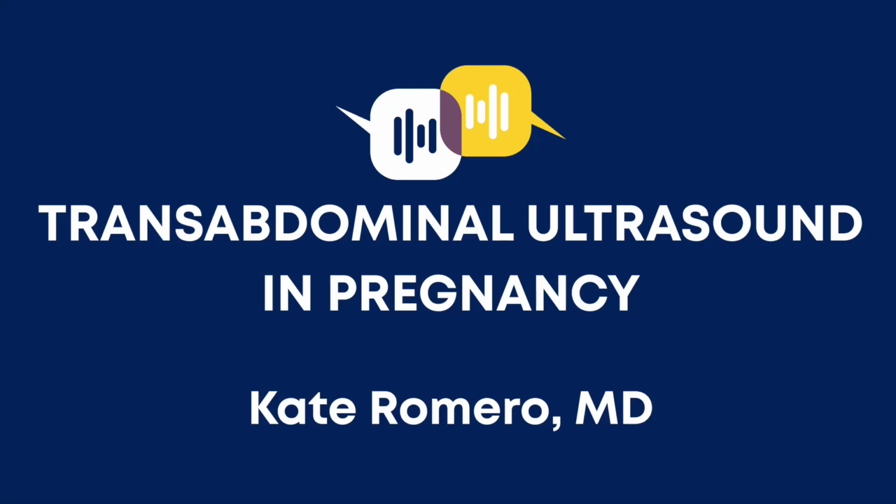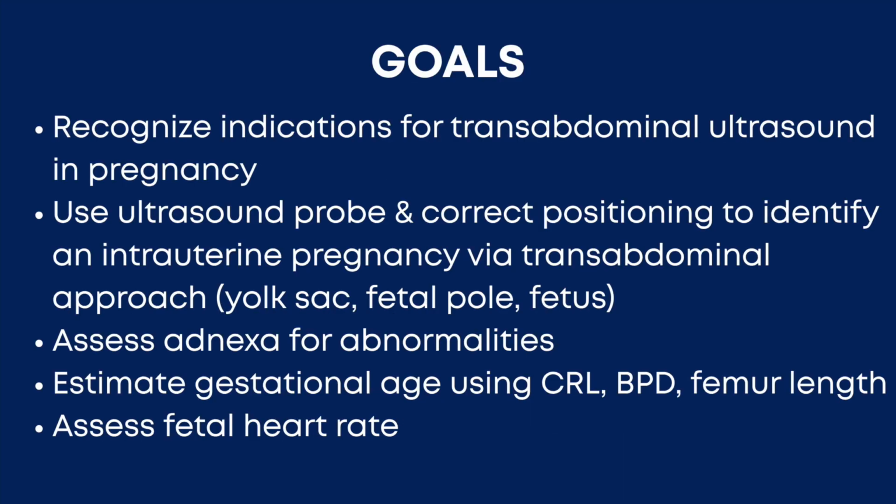Hi everyone. Today I want to discuss the use of the transabdominal ultrasound in pregnancy. So the goals for this presentation are to recognize the indications for transabdominal ultrasound in pregnancy, and to select the correct probe and patient positioning to best assess the uterus and adnexa.